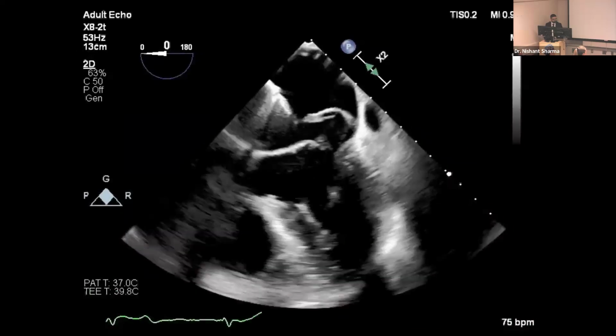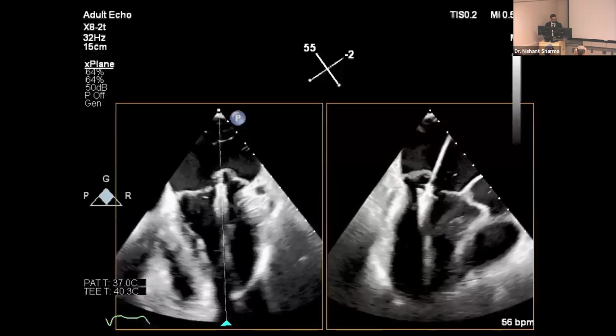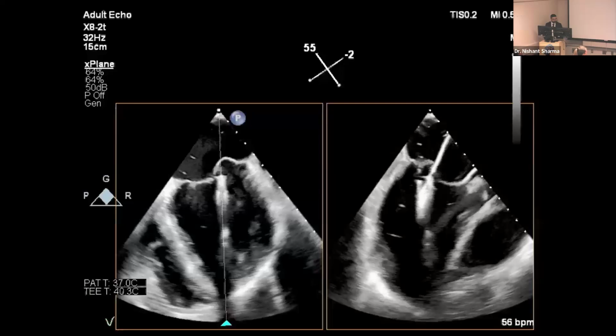And now you're just checking your trajectory with the clip arms open here. Now you're below the valve apparatus, and the goal is obviously to have the anterior and posterior leaflet onto the actual clip arms, and then you can drop your grippers accordingly. A lot of the manipulation is done in the atria before you get down to the ventricle, just because you don't want to be entrapped in all the trabeculae.